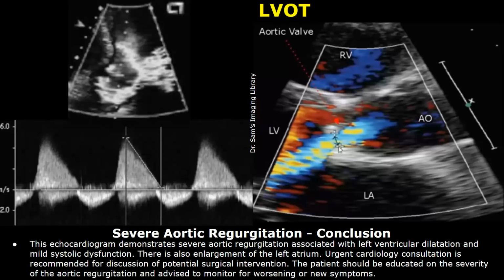There is also enlargement of the left atrium. Urgent cardiology consultation is recommended for discussion of potential surgical intervention. The patient should be educated on the severity of the aortic regurgitation and advised to monitor for worsening or new symptoms.